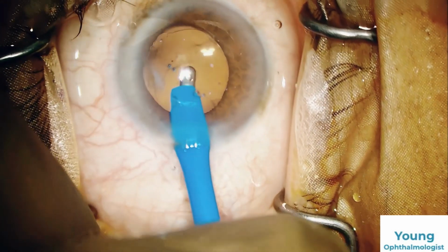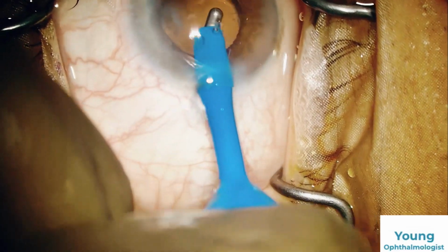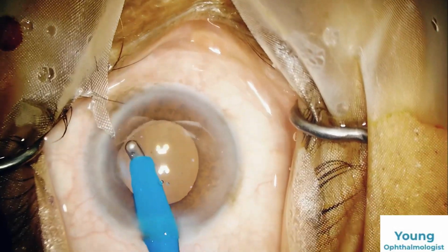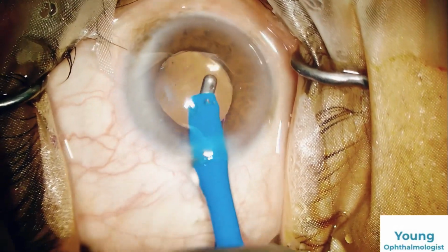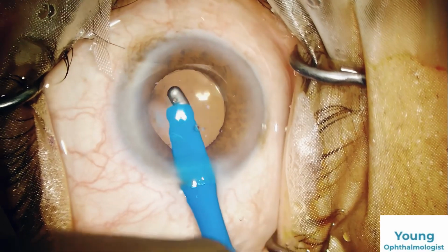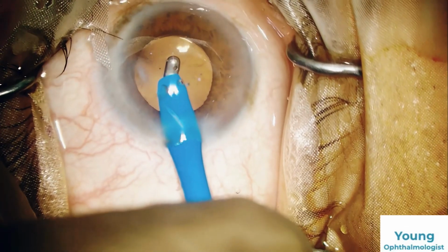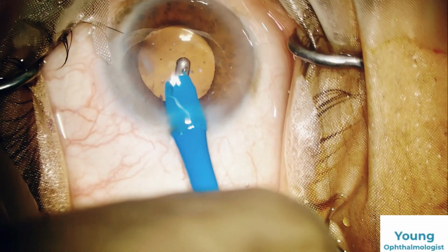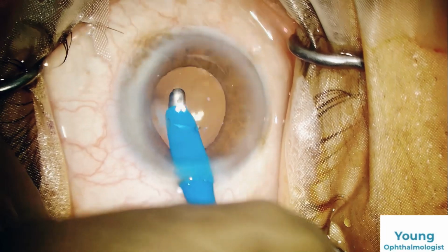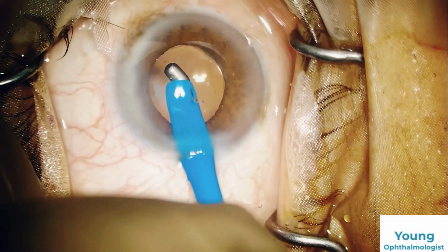Now it's time to do the AC wash. Removal of visco in front of the lens and behind the lens is a very important step. You should give some time to this. The visco should be washed from all the angles, and if you are not able to go behind the lens, you can tap the lens. That also helps in removal of the visco behind the lens. An increase of pressure can be avoided next day.